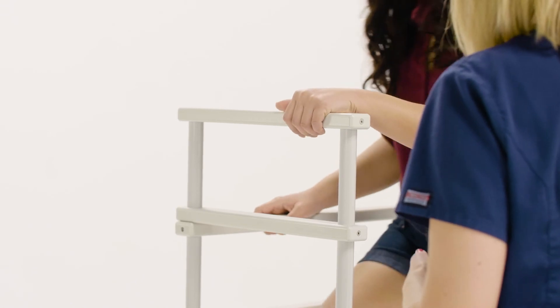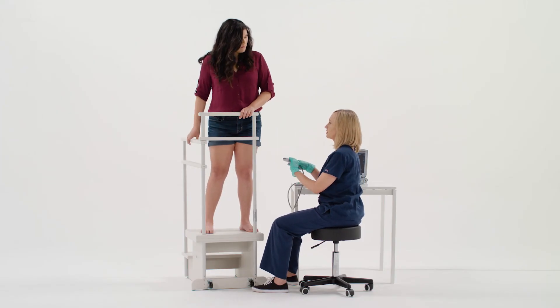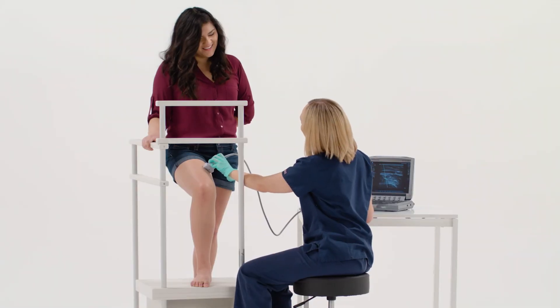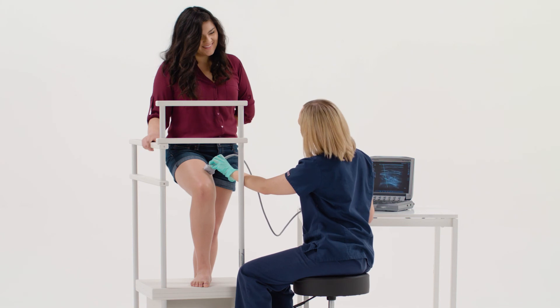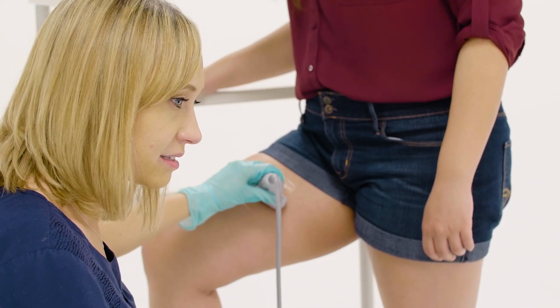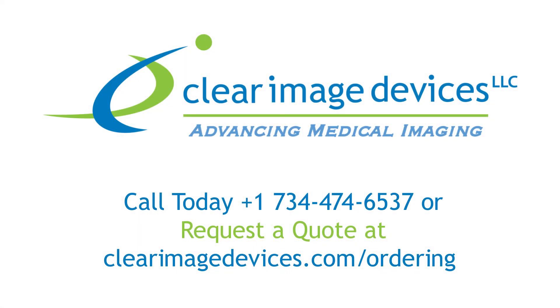At Clear Image Devices, we always put quality and safety first. We're advancing medical imaging every day by bridging the gap between technology and people. As the leading brand in imaging accessories, you can expect the highest quality when you add the standard vascular ultrasound exam step to your imaging exam room. To find out how to make the standard step a part of your practice, request a quote today.